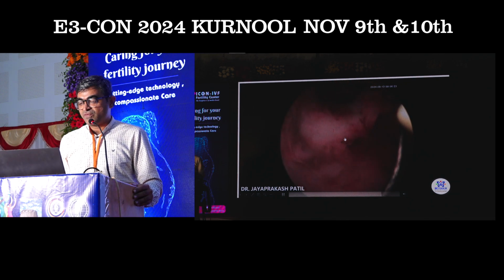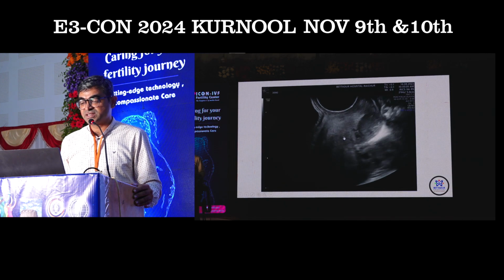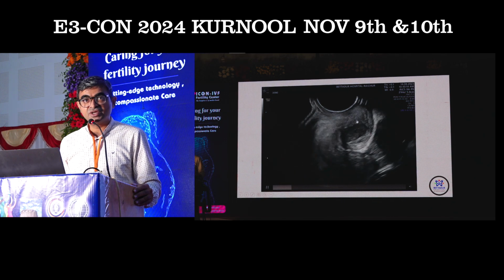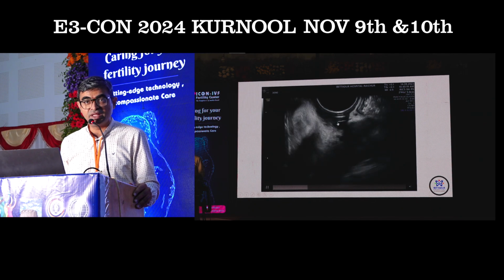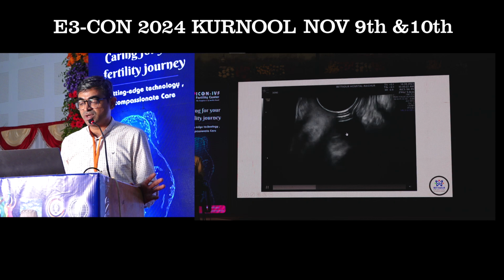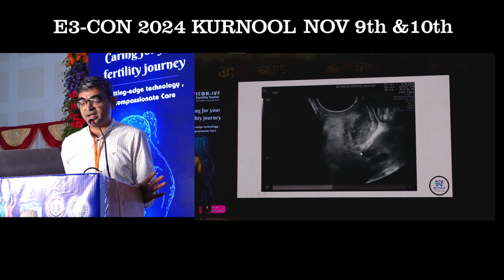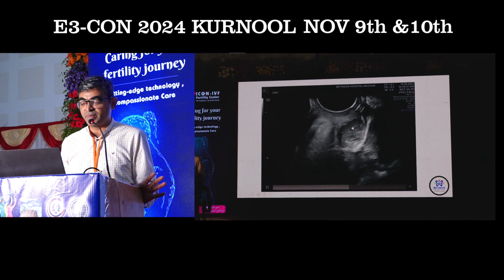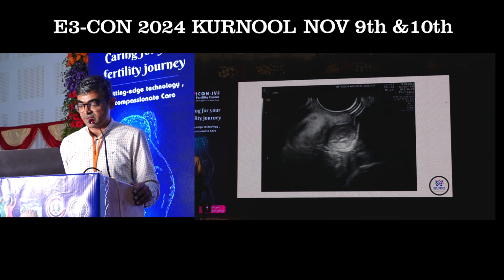Okay, case of lesion in the posterior cervical lip. It is showing ground glass echogenicities within with hyperechoic flecks inside, and you also know in the adnexa and in the POD you are appreciating features of endometriosis that we saw today morning, a small endometriotic cyst and also an endometriotic nodule in the uterosacral. Now I am trying to show a lesion on the posterior lip which is an endometriotic cervical lip lesion. Patient had extreme tenderness while we were doing this, and also she showed features of endometriosis in the pelvis, and there was a very good uterosacral nodule in the same case.